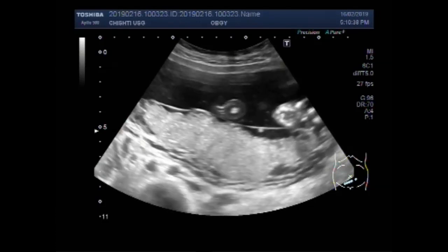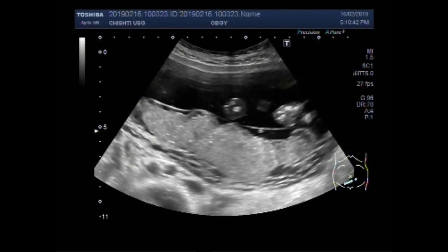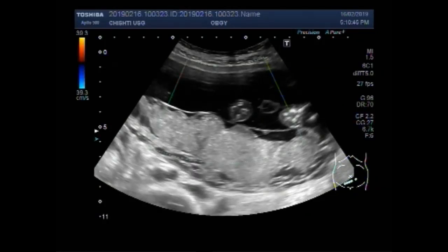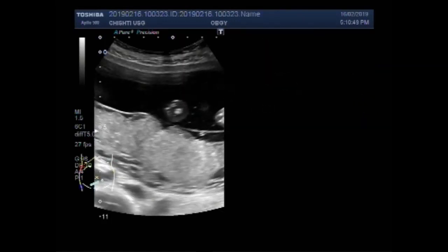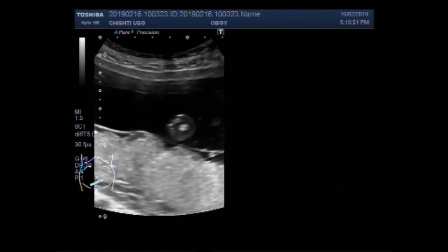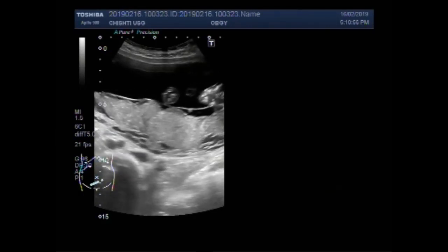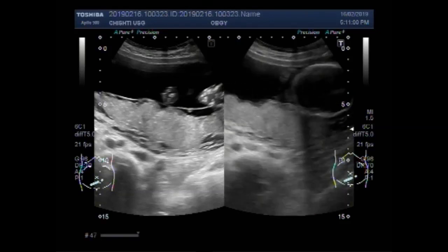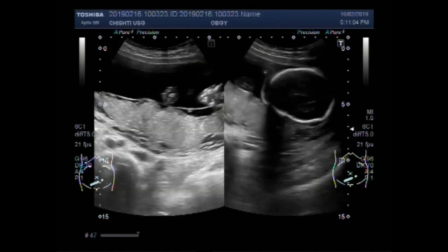You can see the posteriorly attached placenta. Now this is the placenta, and this is the fetal skull bone.